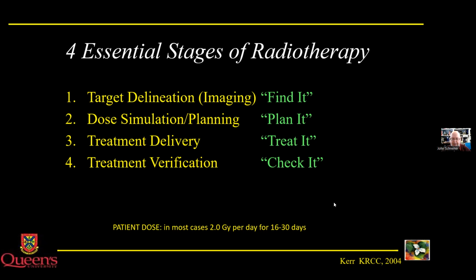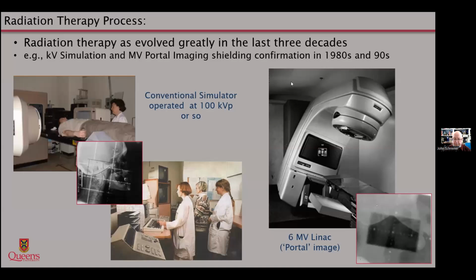So again, as I said before, the trick in radiation therapy is to give this to the target that we're trying to treat, and not to the rest of the patient, and not to the normal tissue.